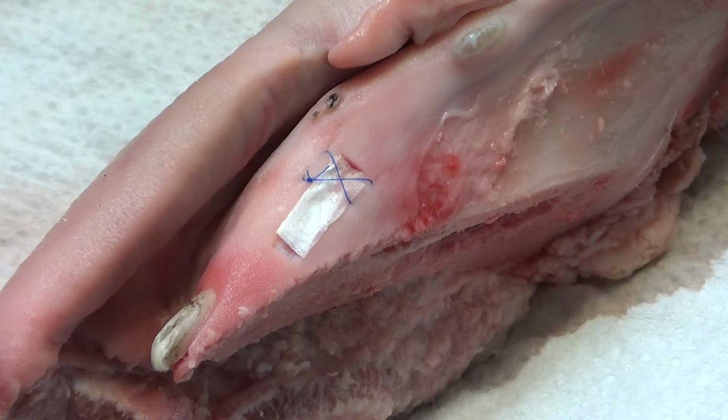Yeah, imagine that in the mouth it is full of blood in a pair of seconds. It is absolutely stable, and if there is too much blood, with the gauze, I don't remember the name in English, just to push and to block the bleeding. Compress, yeah, you can compress, and in 10 seconds it stops bleeding, and then you can start suturing.